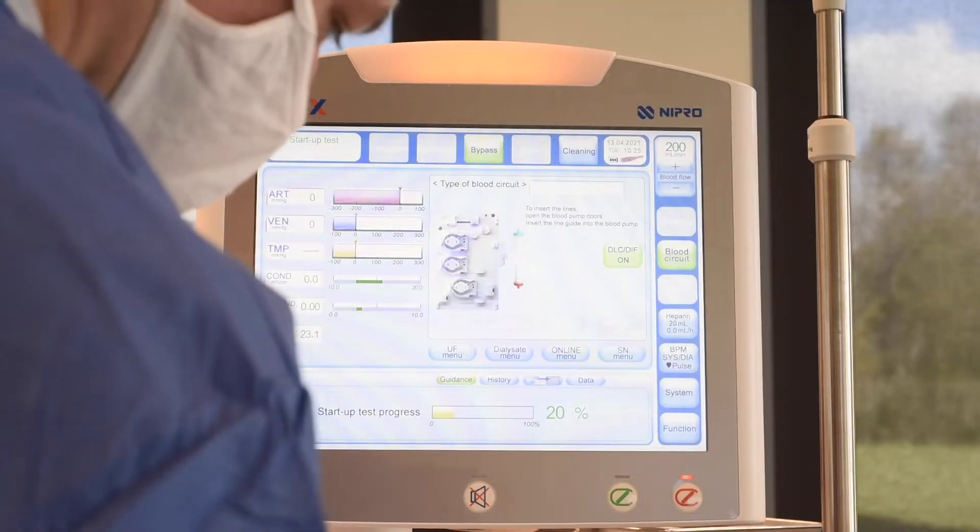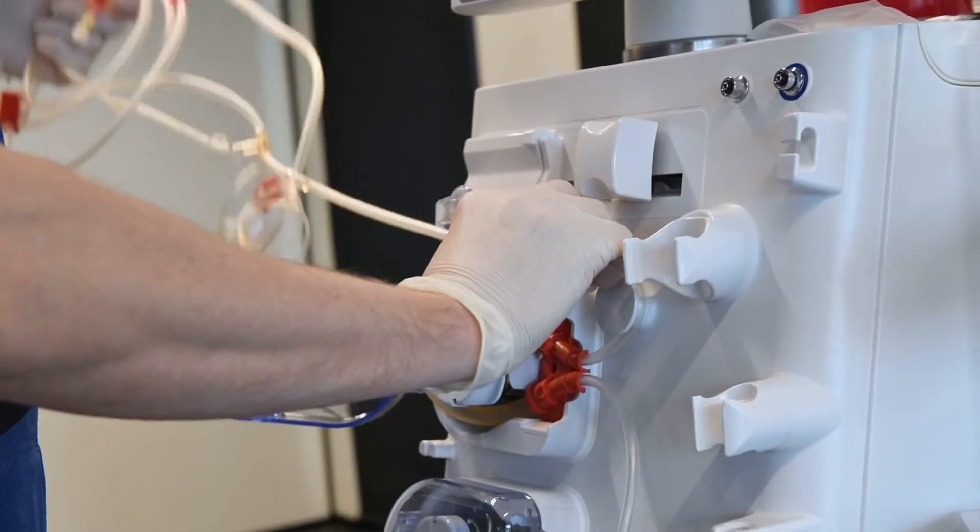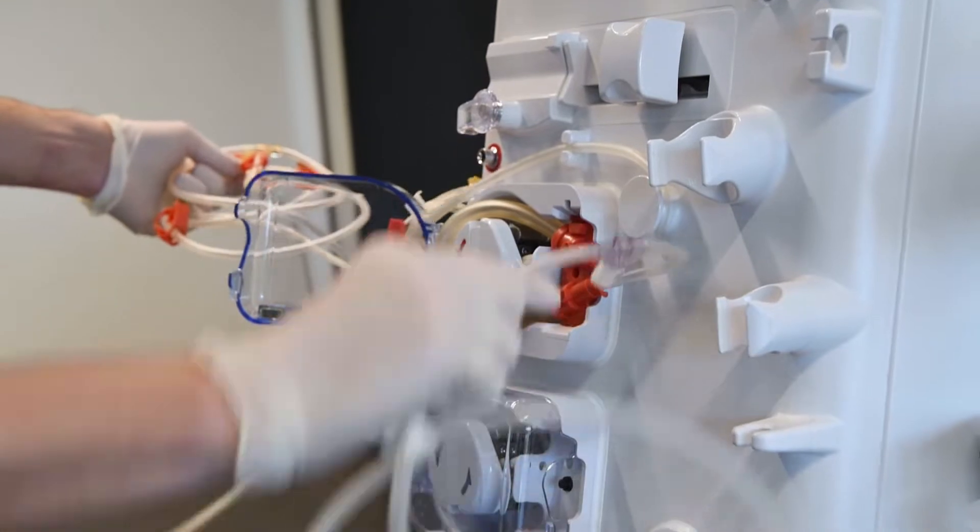Insert the arterial pump segment bottom first and click the top into place until you feel the click and hear the sound. On the screen, the setup for a standard bloodline will appear.